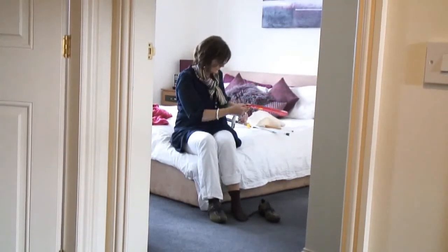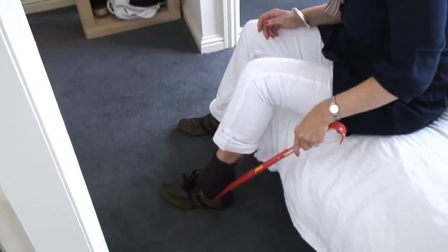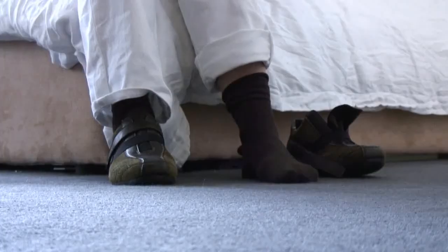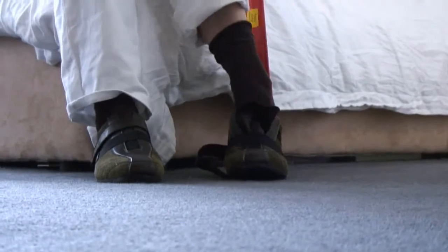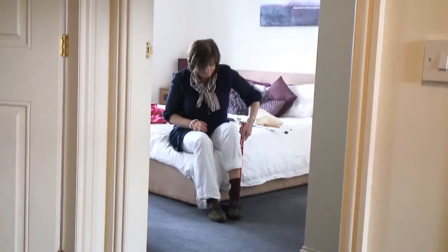So now you have your sock in place, the next thing we would want to do is perhaps put your shoes on. Now we can use a long-handled shoe horn, which would make the process of getting your shoes on a little easier, again without having to bend down. So using the shoe horn, pop your foot in.